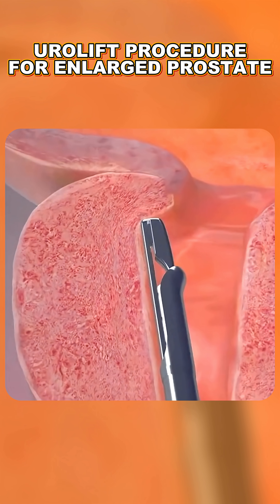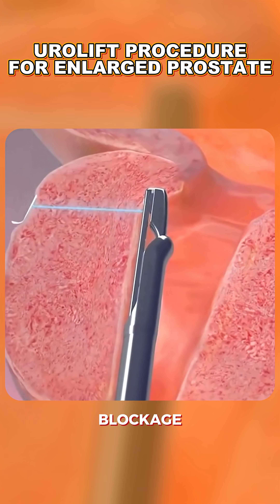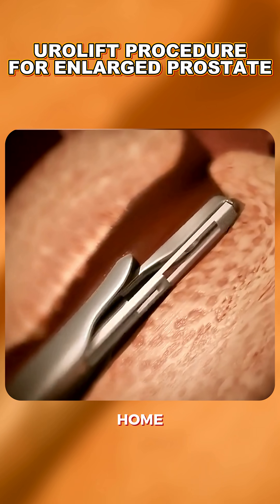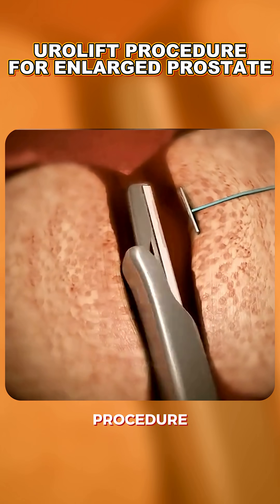There is no cutting, heating, or removal of prostate tissue — just simple mechanical movement to relieve blockage. The whole procedure takes about 30 minutes, and most patients go home the same day with fast recovery and quick symptom relief. And that's how the Urolift procedure works.